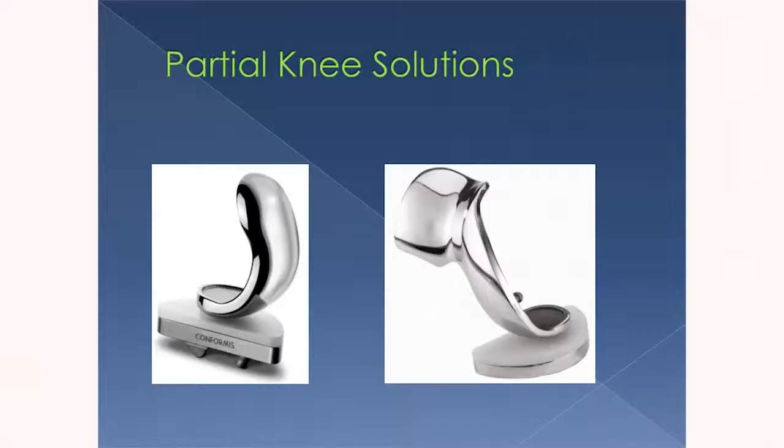And so if you look at these pictures, on the left, this is what's called a unicompartmental knee replacement, which replaces just the ends of the bones that are worn on either the inner or outer part of the knee, or what's called a duocompartmental knee replacement, where we take this implant and extend it around the front of the knee in case the kneecap is worn. This by far is more commonly implanted than this one over here, but I'm showing them to you both just to let you know that they exist.